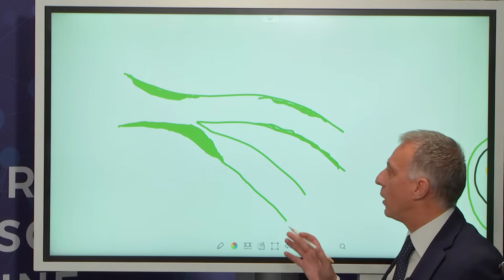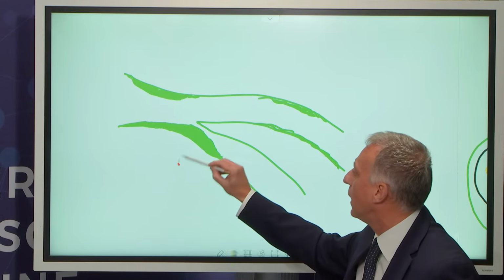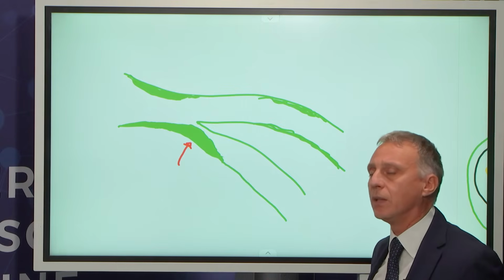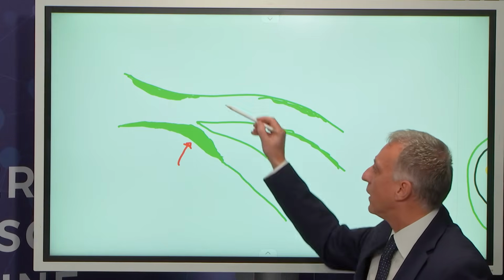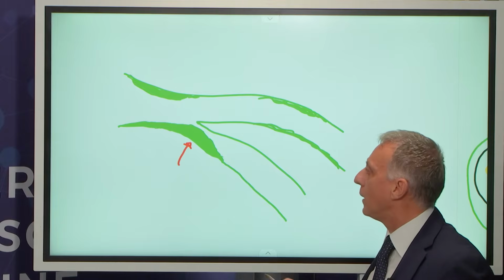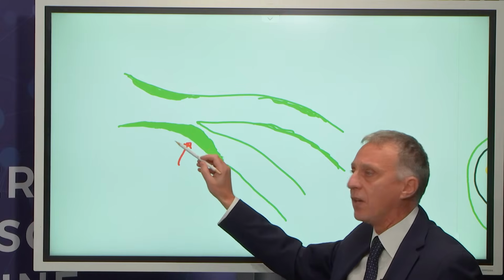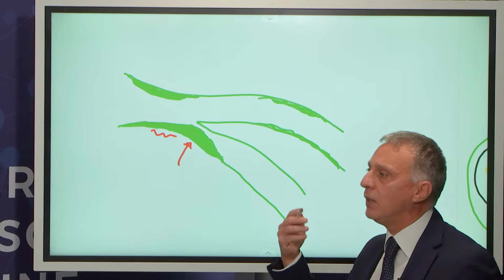And here we confirmed what was obvious, that there was plaque in the ostium inducing a tight stenosis. However, it was also evident that the LAD had no significant disease to be treated, and on the opposite, there was some plaque in the distal left main, confirming that there was, especially in the cranial view, some irregularity.